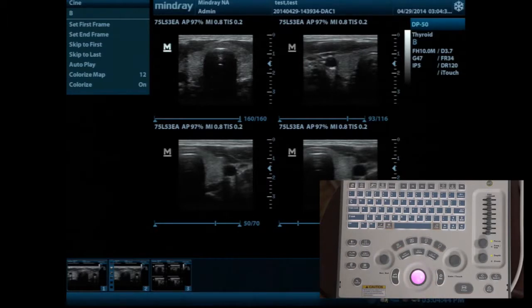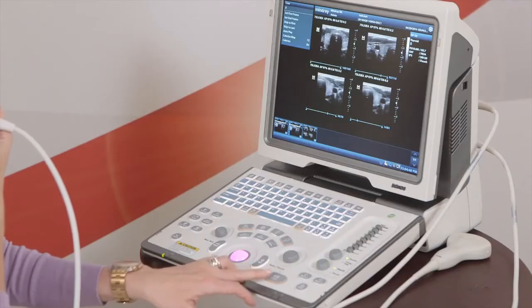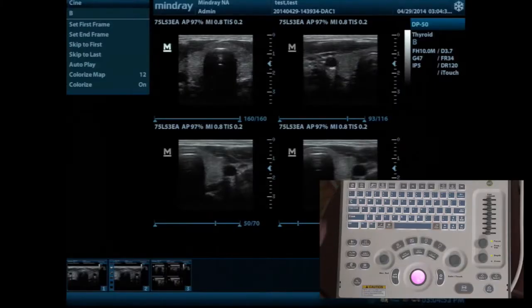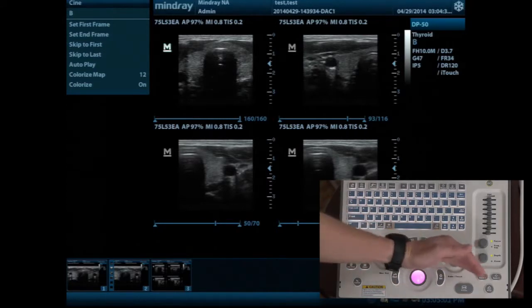When you hit freeze, you'll see that right now it's backlit orange. That means it's active and functioning. You also have a little snowflake up in the top corner, which I always like to point out. It's a little symbol. It shows that you're frozen. But the best way to always know things that are active and functioning is the backlight orange on the machine there.